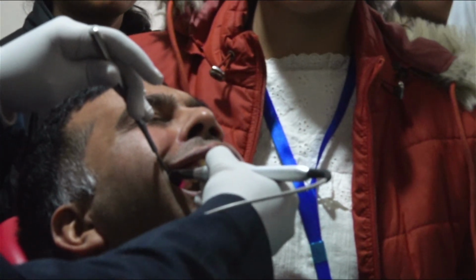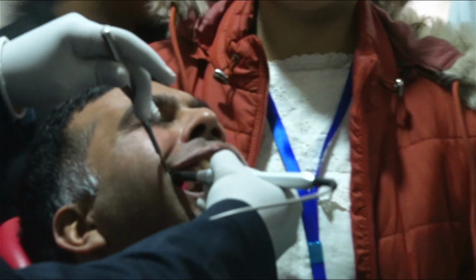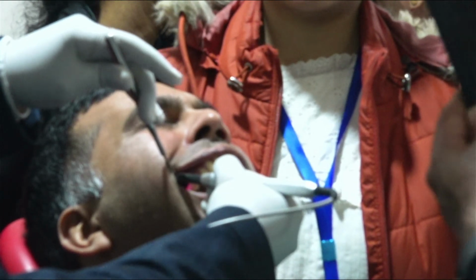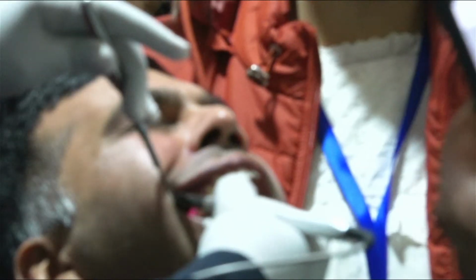Contact mode. All PBM, according to the World Association of Laser Therapy guidelines, has to be contact mode. For every millimeter distance from the contact mode, you will be losing 33% of energy. I told you yesterday. So whenever contact mode is not possible, keep it for a longer period of time to have the dosage. 6 joules अगर मैंने, if you want to move it, you can calculate like this. Scanning motion.